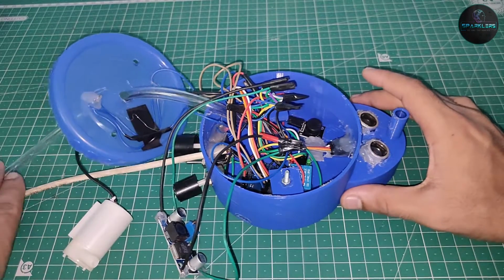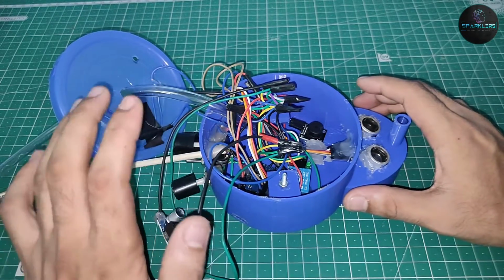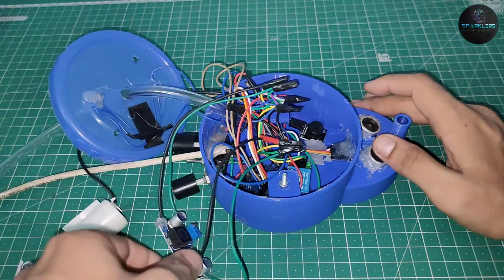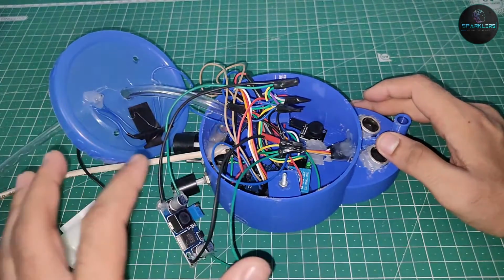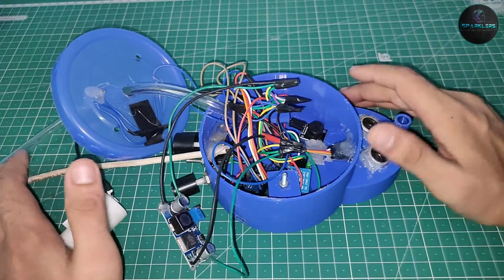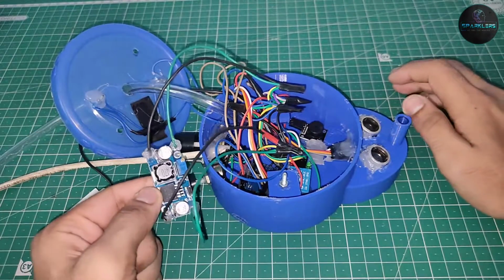But in my case I am using 5 volts. In case of 5 volts, you can give 5 volts to all the components, but there is a problem. If you give 5 volts to the Arduino through the V-in pin, it will not work properly, because the Arduino V-in pin requires 7 volts to 12 volts. So what I did here, I took the 5 volts from the supply. Here I am using an XL6009, which is a boost converter. I am converting that 5 volts to 7 volts and giving it to the Arduino, and for the remaining parts I am using the 5 volts from the power supply. So I am giving 5 volts to everything, but for the Arduino only I am giving 7 volts, converted using this XL6009 module.